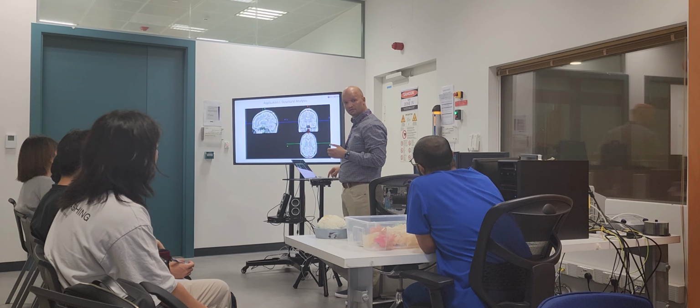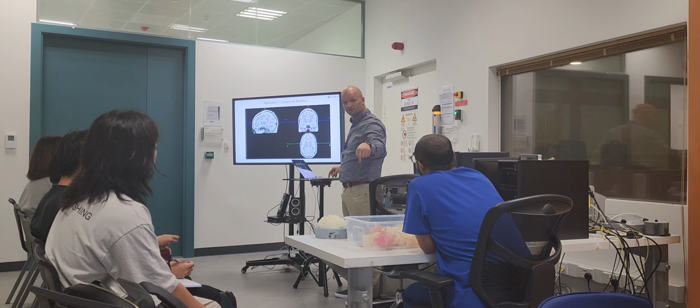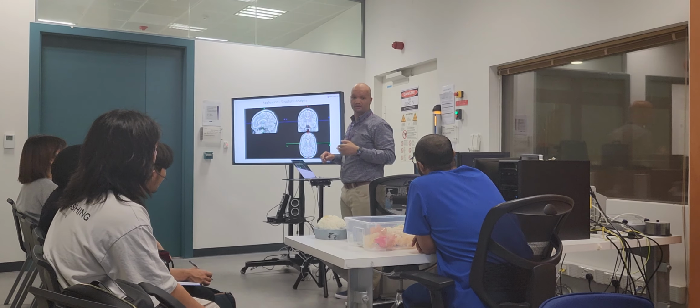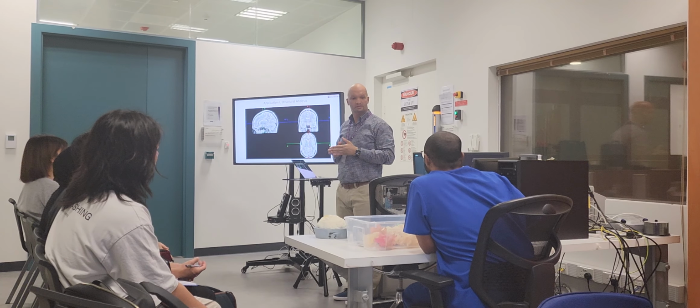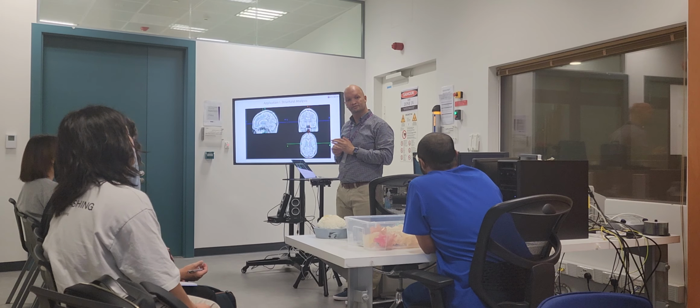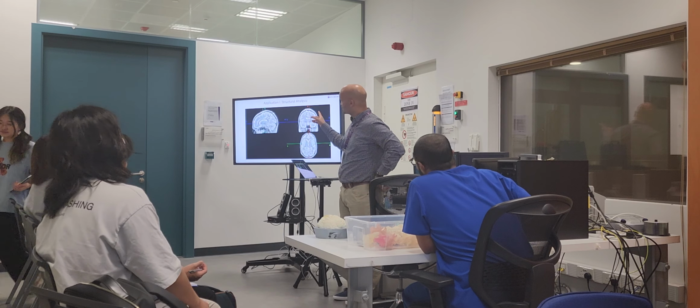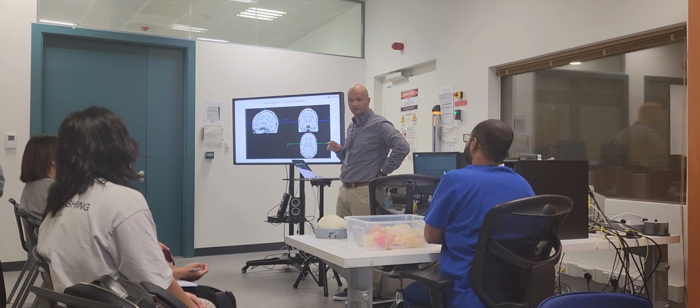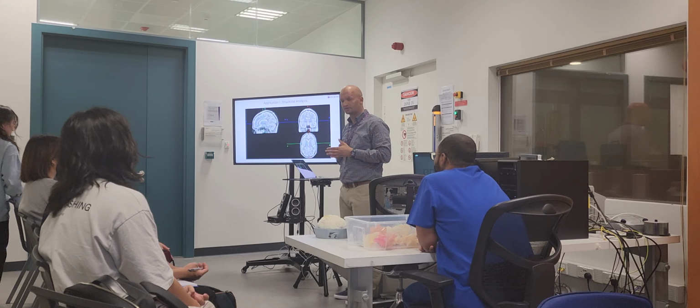What happens if someone is moving a finger while they are doing MRI? You'll do this today. So what would happen to the images? If you move your head, yeah. I'm tapping my fingers, and you're doing MRI, and I'm not tapping. Would you be able to see a change in the image? Not in the structural scan, but in the functional. We'll go to the functional scan. So initially we need to look at structure.